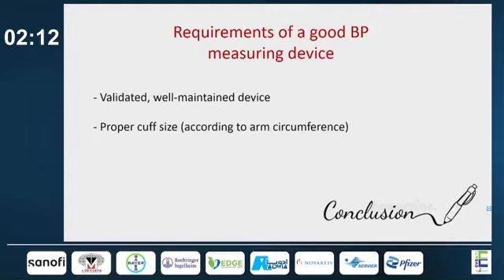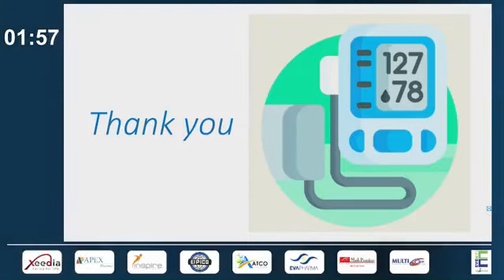So to conclude, regarding the requirements of a good blood pressure measuring device, you can use any device provided that this device is validated and well maintained, and take care to choose the proper cuff size according to the patient's arm circumference. Thank you.